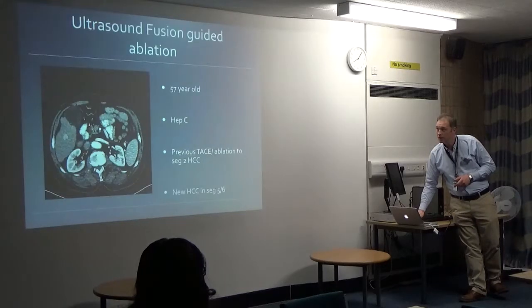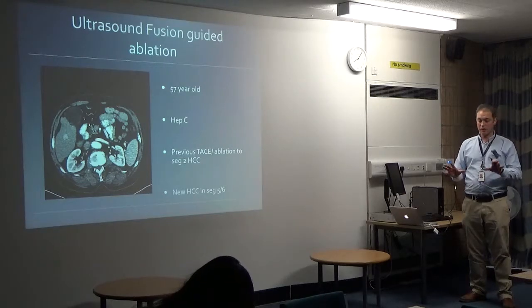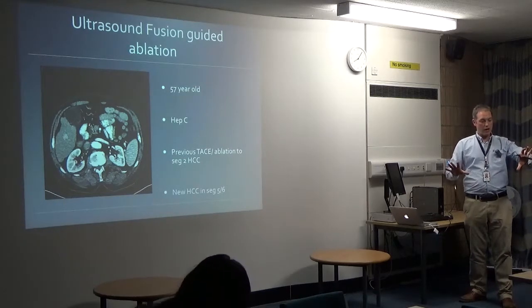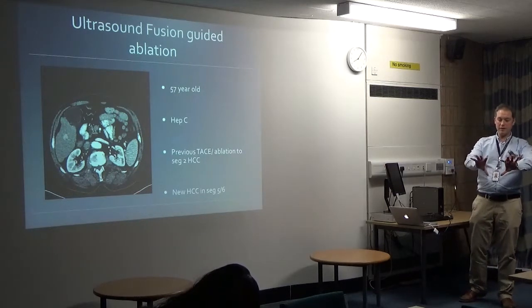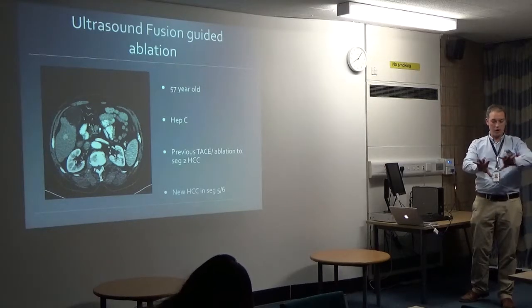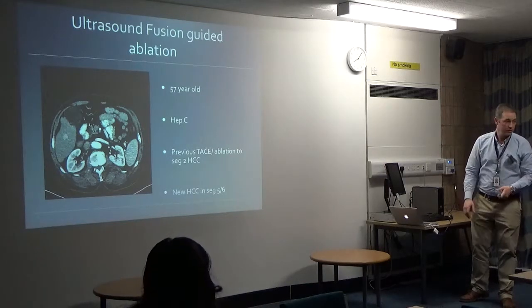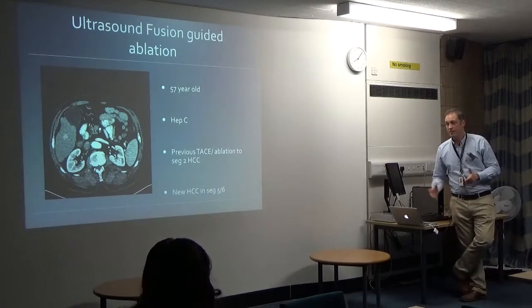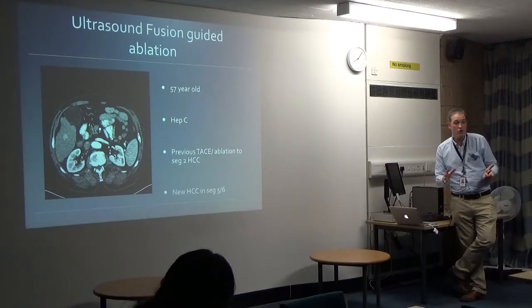So something we've developed very recently, and we're one of the few trusts in the country to be doing this, is using a very fancy ultrasound machine that can actually overlay a CT scan or an MRI scan the patient's had with the ultrasound. And even if I can't see it on the ultrasound, using the CT scan over the top of it shows me where it is, and I can treat it. It's good stuff. Now that machine's on loan at the moment, but we've done about 8-9 patients successfully using this treatment, and otherwise those patients wouldn't have been able to have that potentially curative treatment.